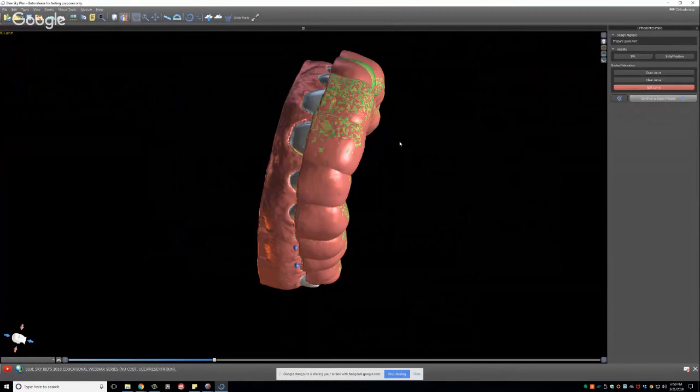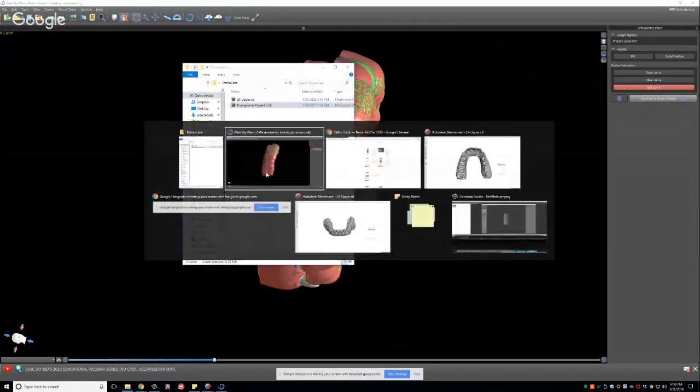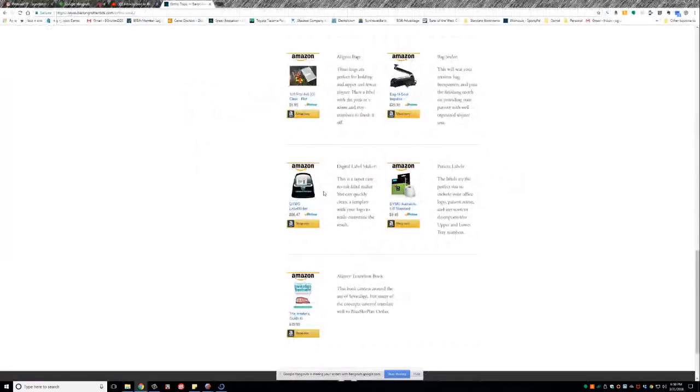In addition, there's packaging, which is a big question I get often. How do you package these for patient presentation? We use a label maker and little Mylar bags. We slide the bags in with the label that has our office logo and name on it, and then we seal the bag. It keeps everything organized well, and it looks pretty nice.